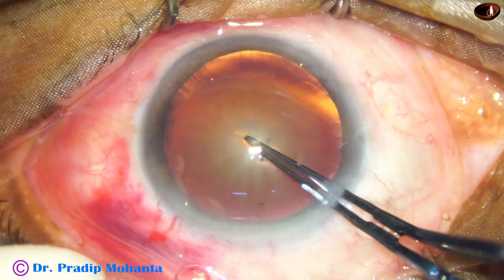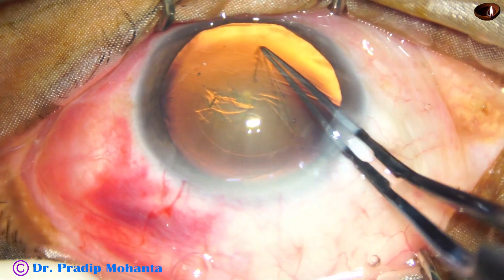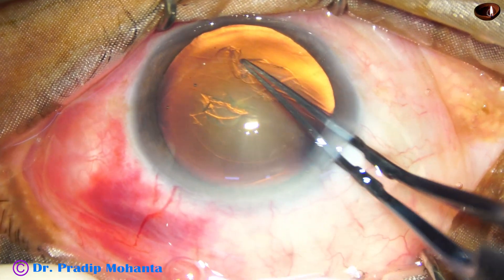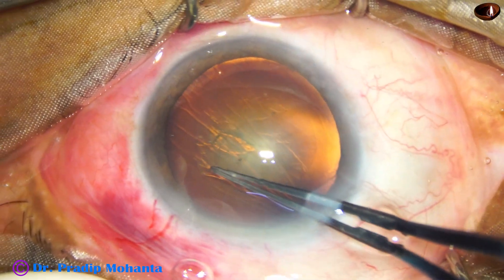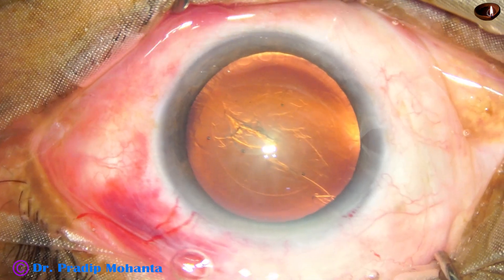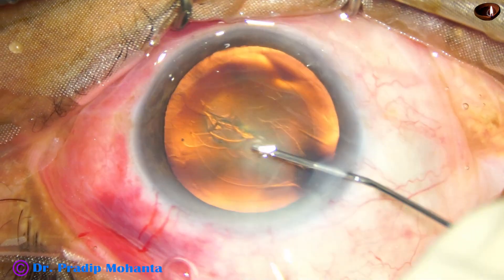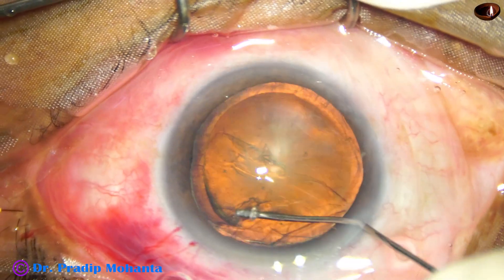Now see the capsulorhexis. The capsulorhexis is made with utrata forceps. The tip of the utrata pierces the center of the capsule. A capsular tag is raised and this capsular tag is guided all around to get an adequate sized rhexis of about 5.25 mm.